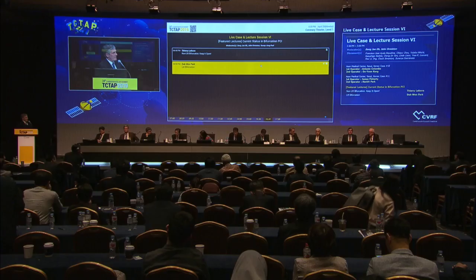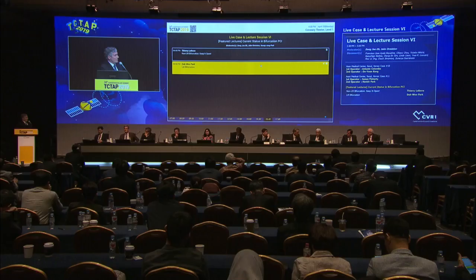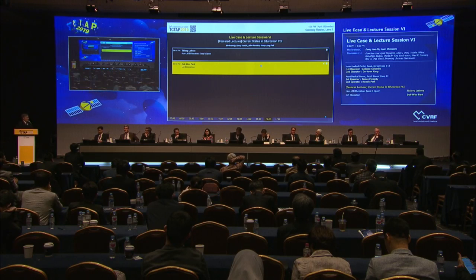What about choosing the diameter from media to media in IVUS? From media to media, because you have a Glagov effect, when there is disease the vessel is increasing in size, so the size from media to media is overestimating the size of the vessel, just because of the Glagov effect. So it's very important not to follow this rule because you get a too big stent, and then you create areas of low shear stress. And you can close the side branch. Of course, you can close the side branch by pushing the carina, yes.